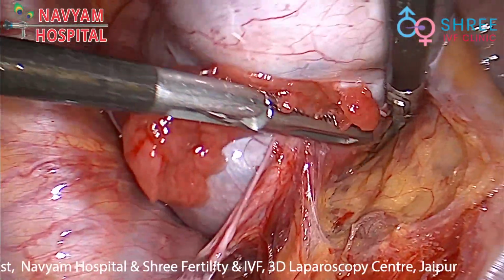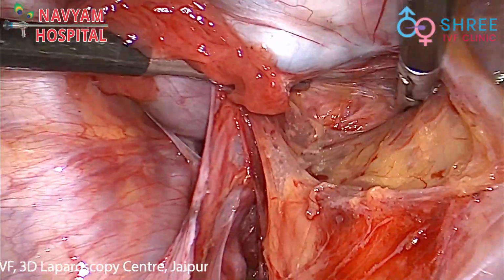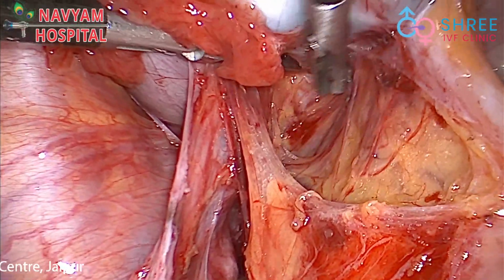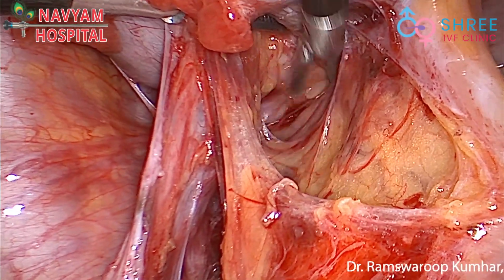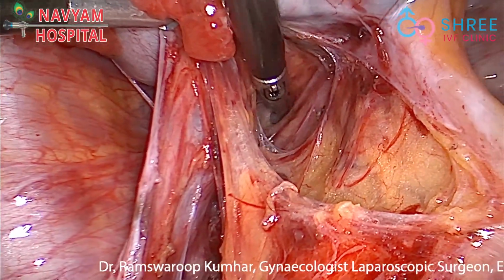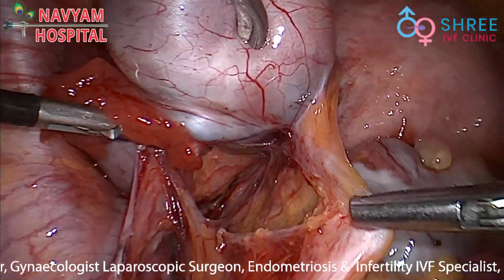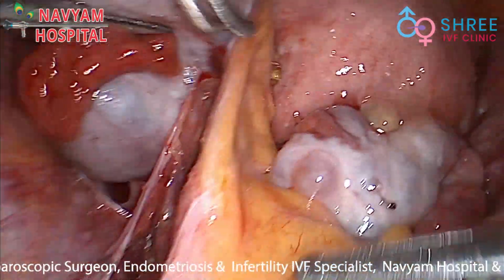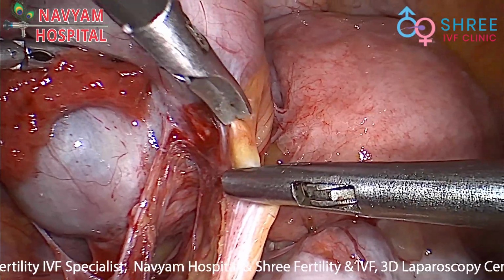Gentle dissection was carried out here to dissect the bowel away from this TO mass. Blunt dissection will help to dissect this bowel. A few more cuts were applied to dissect the bowel away from this TO mass.